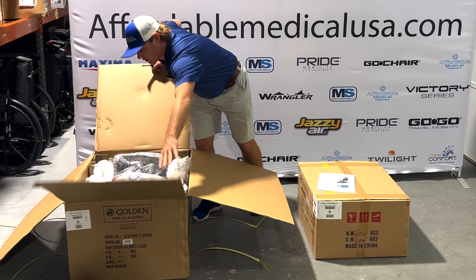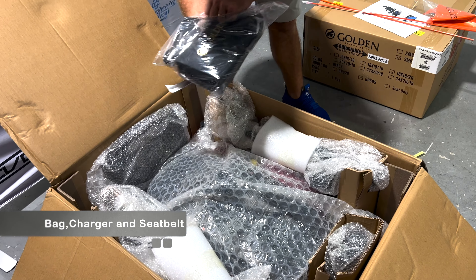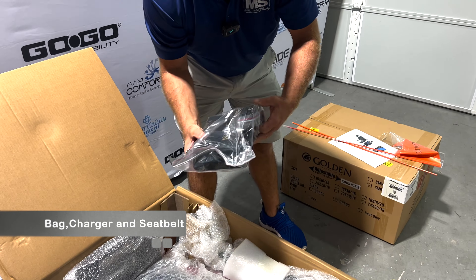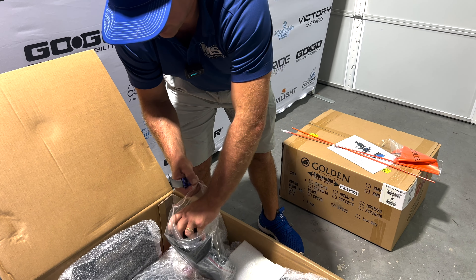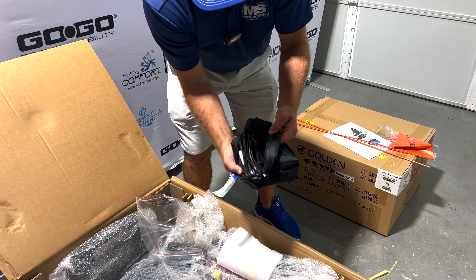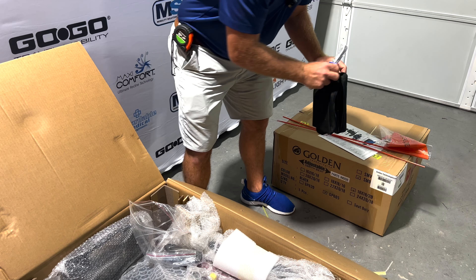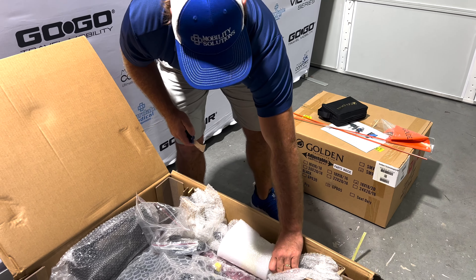First thing you're going to do is come in here and open the box. This is going to be your charger. This is going to be a seat belt inside of here. It's pretty nice to have a little bag, and you can do a couple different things — hang this behind the headboard. Here's your charger. You want to charge it when you first get it. It's good to charge it up overnight.